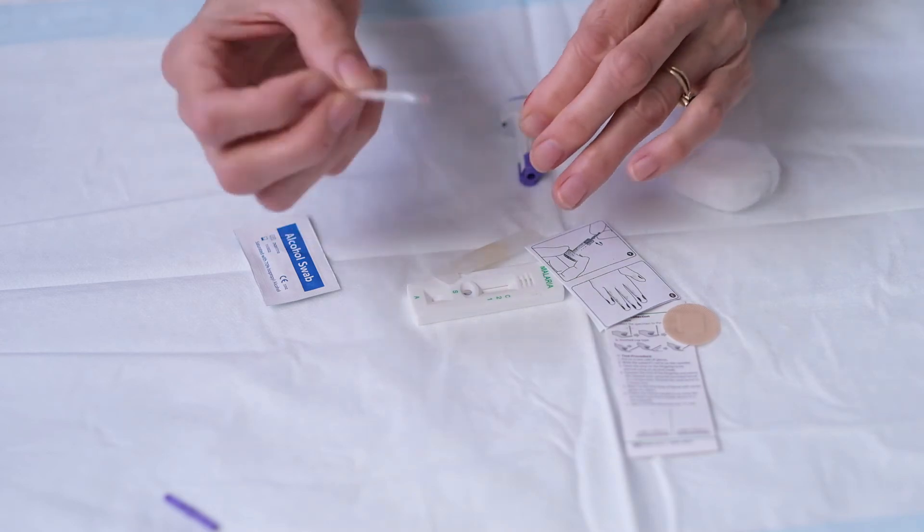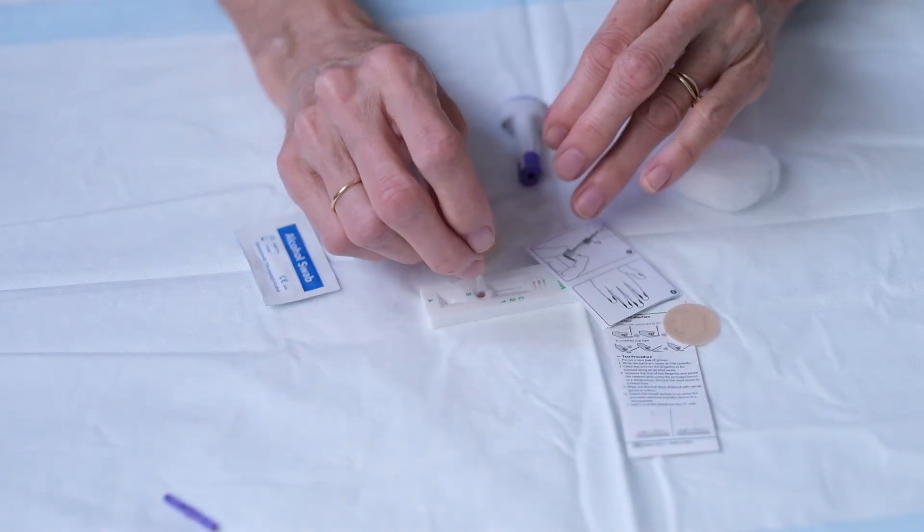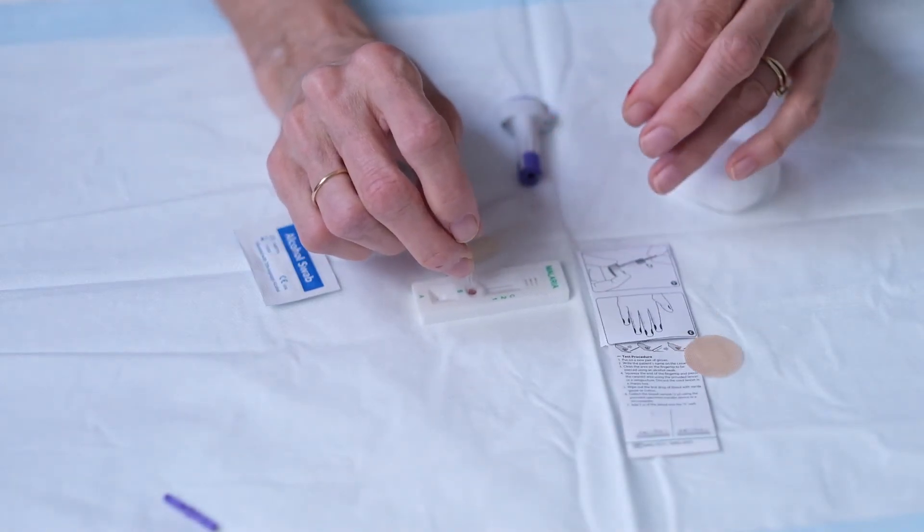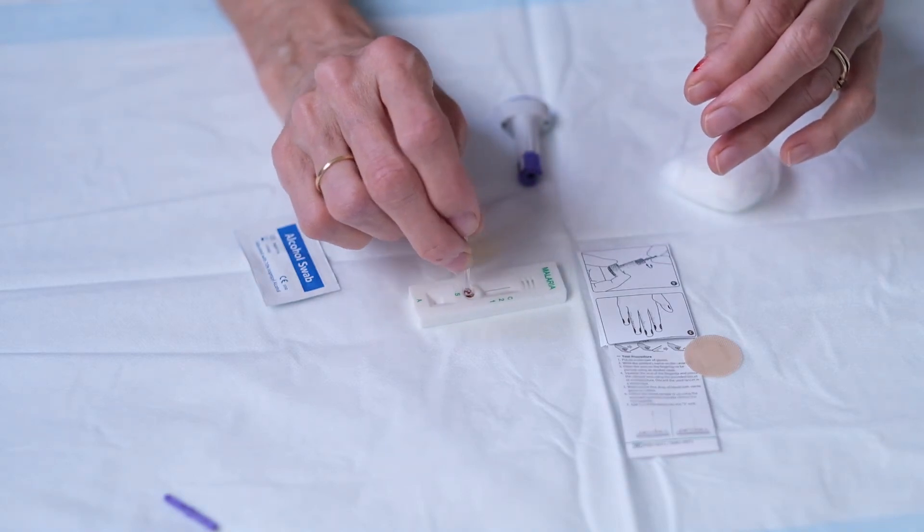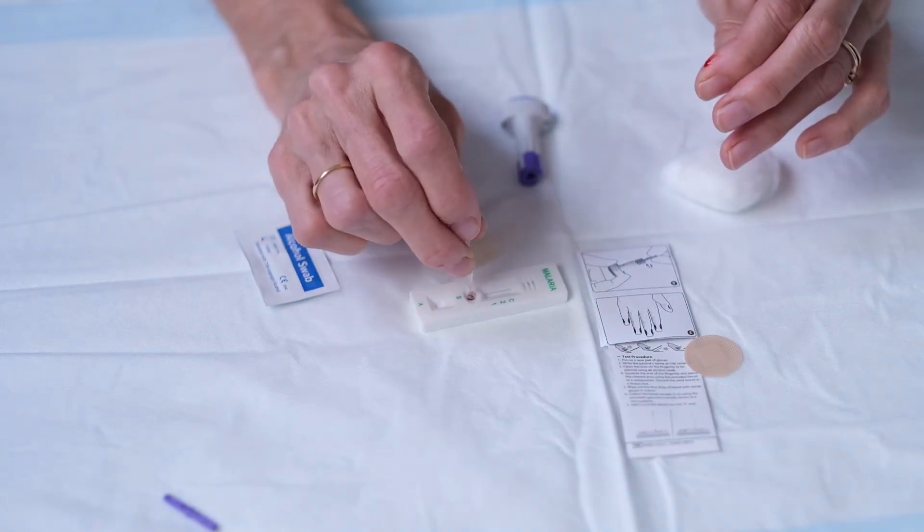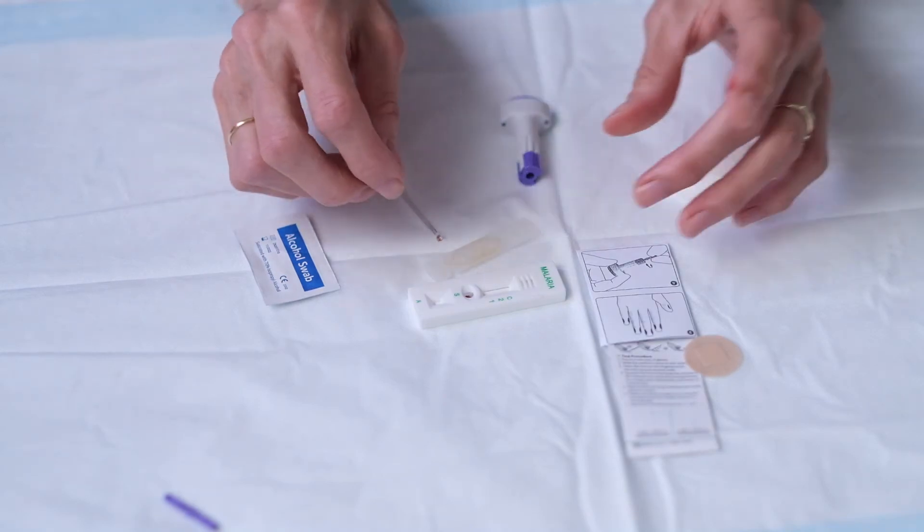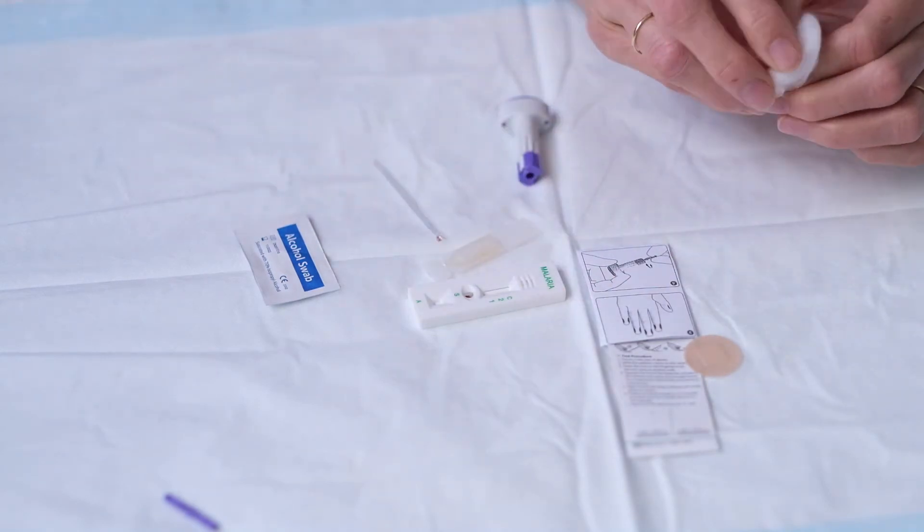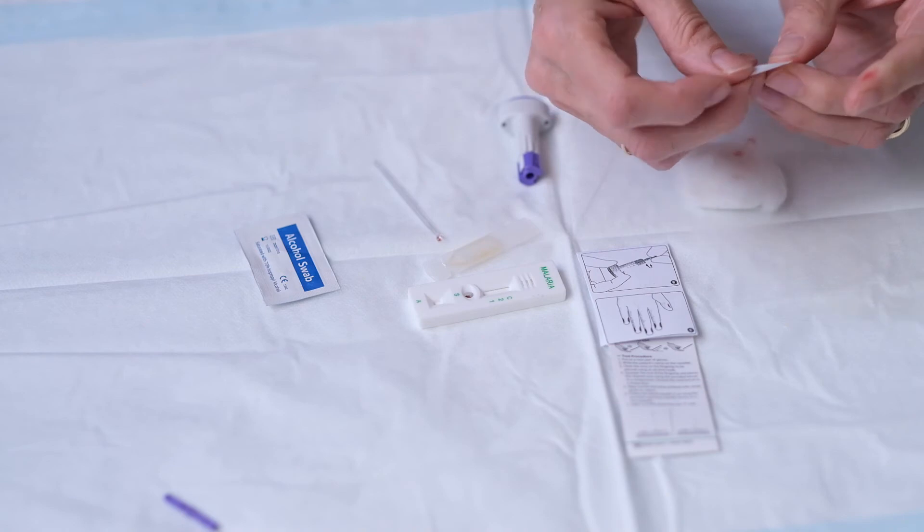So you've got the little blood in the little cup and you put it inside the round hole on your cassette. And it conveniently includes a small band-aid so that you can stop the blood getting everywhere.